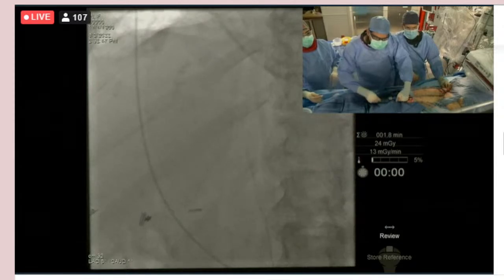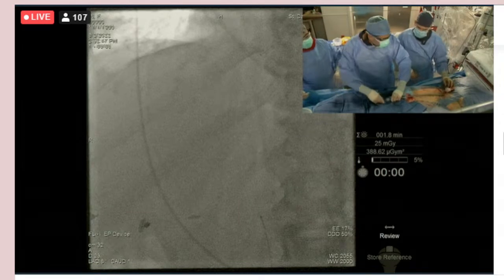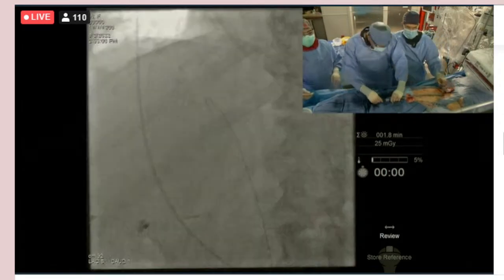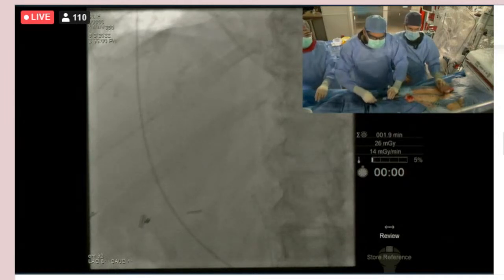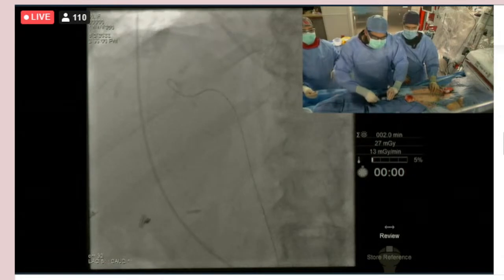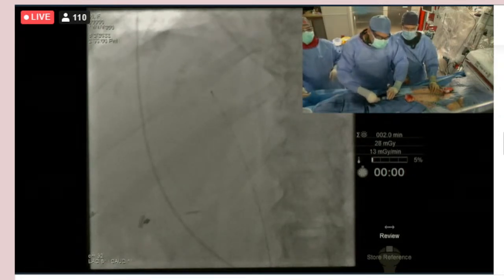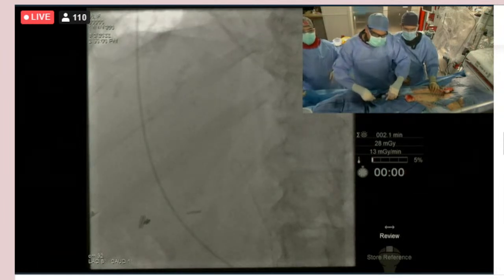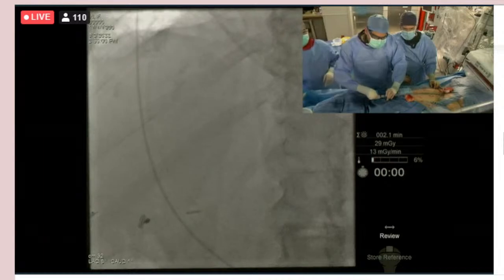Well, while you guys are doing that, there's a question, maybe I'll ask the panel, and if there's anybody in the audience, a question online. Do you close the skin level with something at the end, for example Dermabond after pre-close? No, I don't. I usually don't. No. I've never used that. We typically use a figure of 8 stitch with 0 silk and leave it in for 3-4 hours. I do the same, figure of 8, yeah.